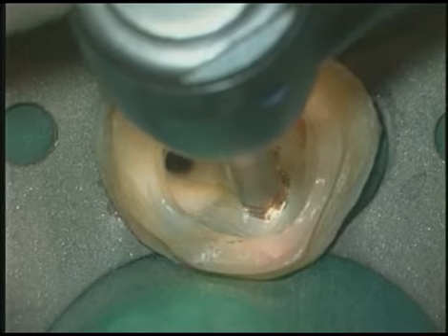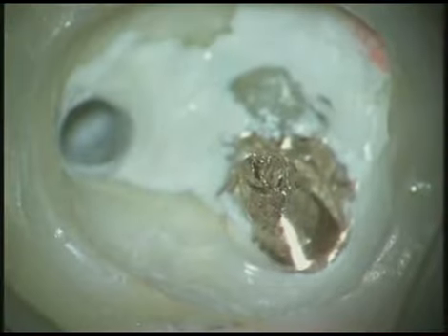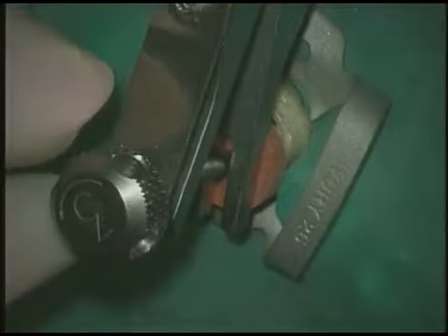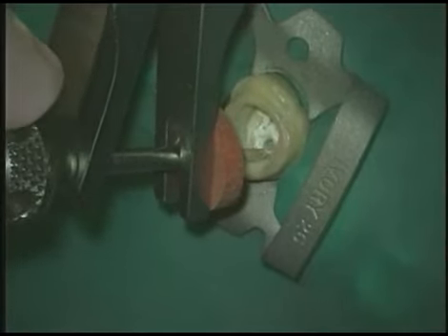Mill down that post with the trephine. Very easy to do in cast as we've seen earlier. We can now engage a tap. It's drawn down and tightly secured. Protective bumpers are used as per usual. Now as we turn the screw knob, many times as it gets tighter and tighter, it resists movement. Learn to use ultrasonics. Hesitate a moment. By hesitating, the constant pull on the post in conjunction with ultrasonics can be very successful and potent at removing a post.